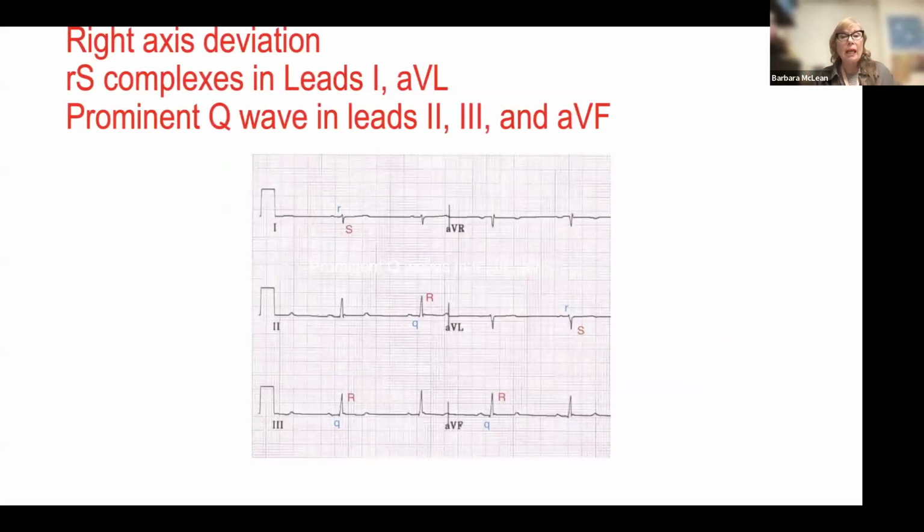So I'm looking at this EKG. There is no doubt in my mind something's wrong with this EKG. Okay, primarily downwards in lead 1, primarily upright in AVF. This is the right axis deviation. Now, the first thing I think about with right axis deviation is right bundle branch block. I only have my limb leads here, but with right bundle branch block, current goes to the right. So I'd expect a big upright in AVR, which I don't have. Okay, and my QRS is not wide.